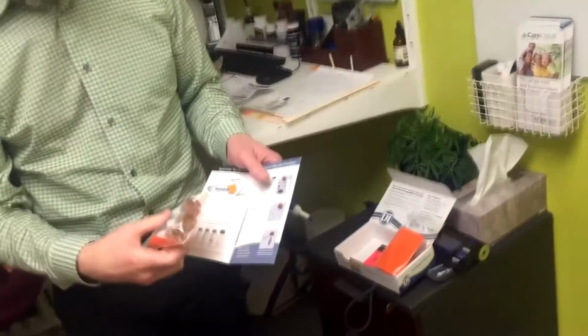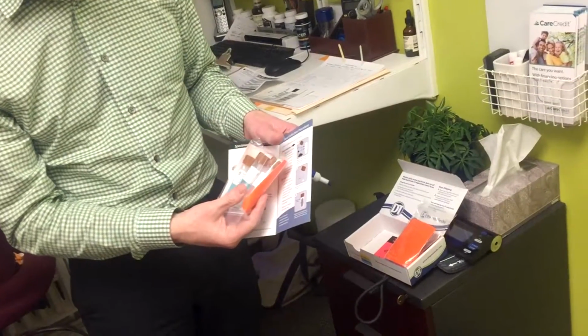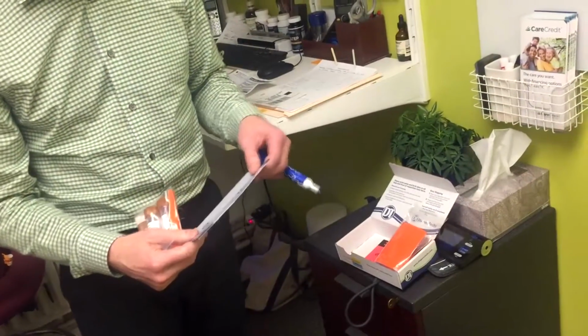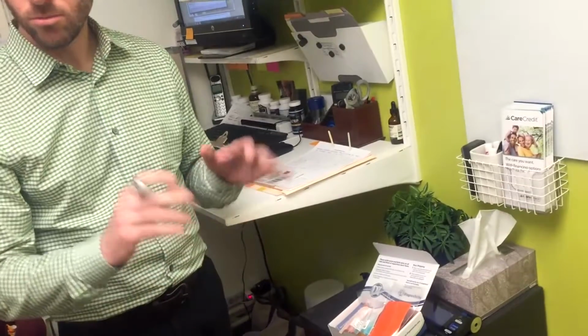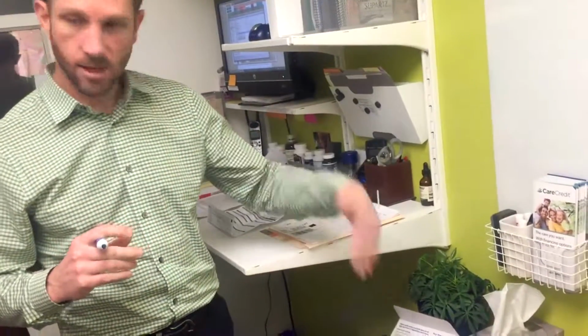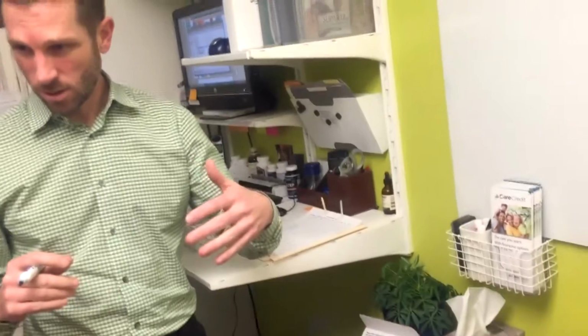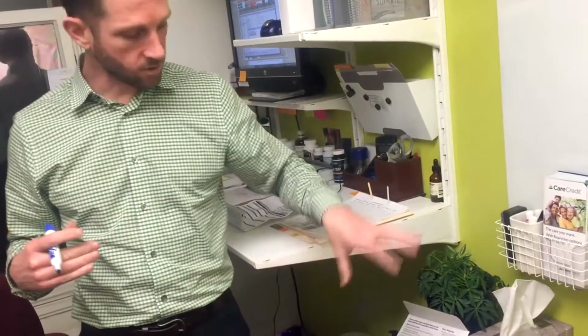So now you're going to notice that there are 2 blue vials and 1 pink one. Here's how you're going to collect and schedule, because you have to collect these all together, and I need to show you how that's done. This weekend, Friday, Saturday, Sunday, it's a 3-day collection process because the lab needs to get this as soon as possible so that it's fresh. So on Monday morning, you're going to mail it out and it'll get to the lab Tuesday or Wednesday. Whereas if you do this towards the end of the week and mail it out on Friday, it won't get there until next week, and the stuff will go bad.